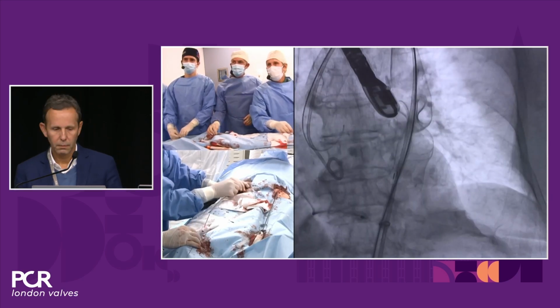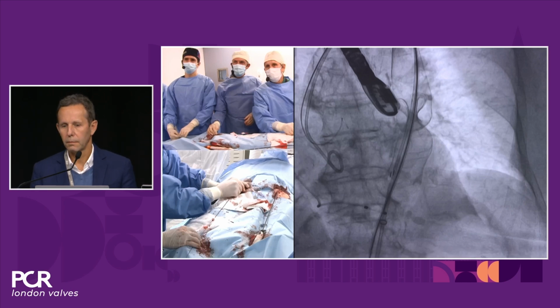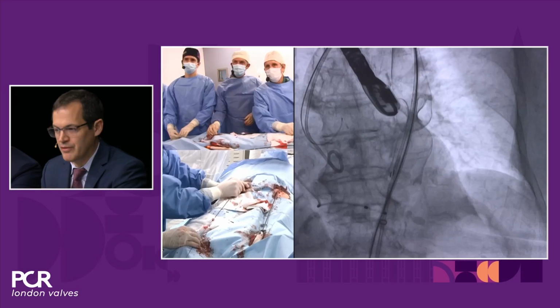Now we pause here, maybe exchange the pigtail for a second. Let's pause. We've seen the deployment of the Emboliner, and I think it brings up some really neat features. I think people may have appreciated the dilator on the sheath is actually a balloon, and that allows you, with this integrated sheath, to enter the body, advance it to where you want it. You then deflate the very tip balloon and withdraw that. The deployment then is a simple pin and pull, as Fabio beautifully demonstrated.